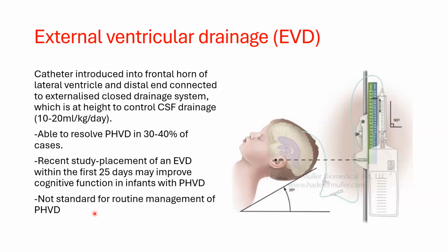Okay, so I guess the risk of infection is very high in this procedure. Sorry, Dr. Nashwa, I couldn't hear you clearly. The risk of infection is very high in this one. Yeah. I saw it 2 times only in the past, like more than 15 years ago. Clearly it looks like you have a closed drainage system, but it's prone to infection like anything, because your CSF, your ventricles are open to a system which can be prone to infection.